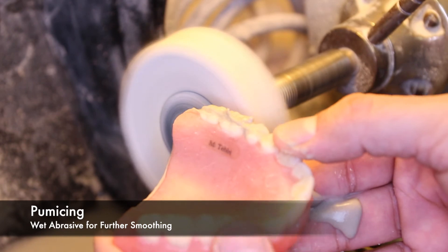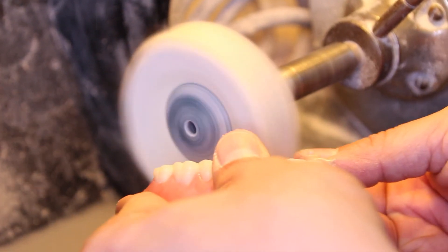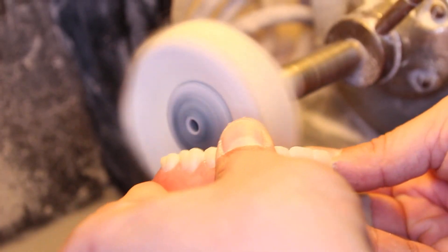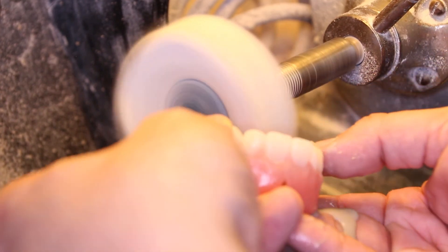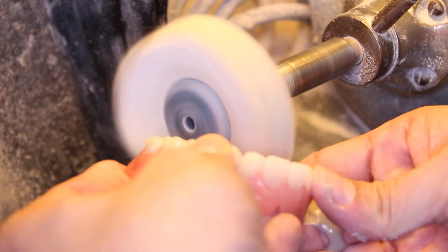The next step is pumicing, which is making use of a wet abrasive that feels almost like wet sand. This will smooth the acrylic surface. Wet pumice can be manufactured in different consistencies and grits, but they are usually used with rag wheels and lathes, as seen in this video.